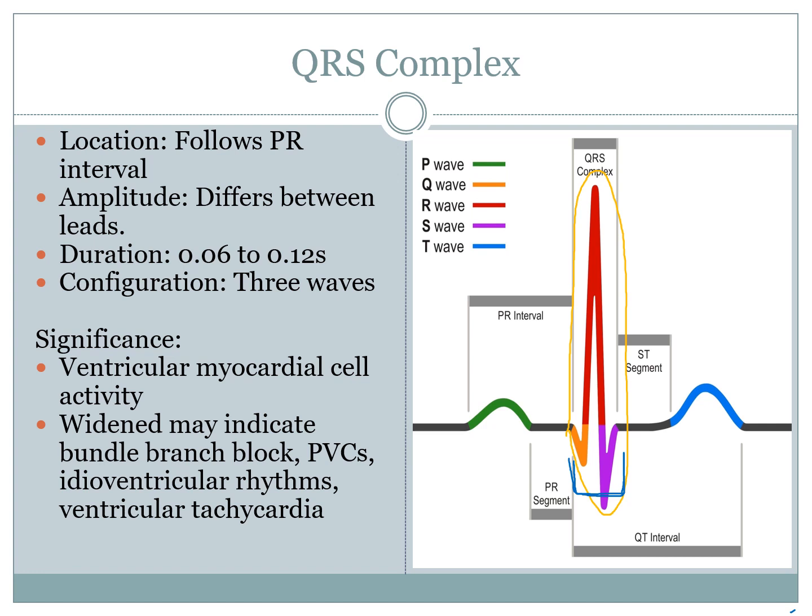Okay, now when the QRS complex is wider, it essentially means that either the contractions come from a different area, so it's not coming from the AV node, or you've got a bundle branch block, so you've got a slowing down of the actual travel down the bundle branch itself. Okay, so that's what happens when you get a widened QRS complex. Now, at the same time that the QRS complex is going through this ventricular depolarization, you're also getting atrial repolarization, but the millivolts aren't large enough to see. Okay, so it just gets soaked up by the QRS complex.